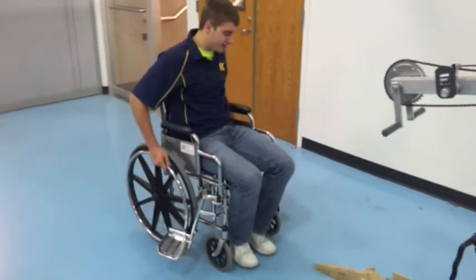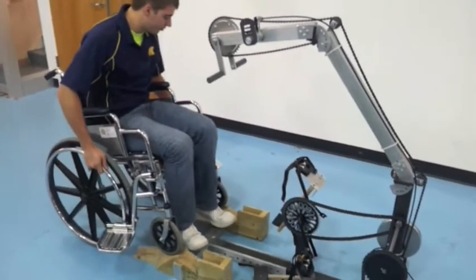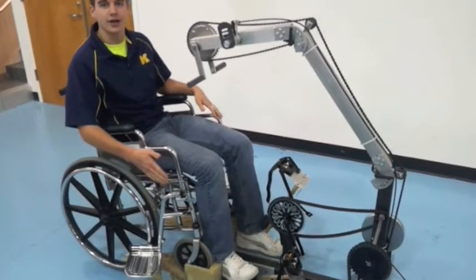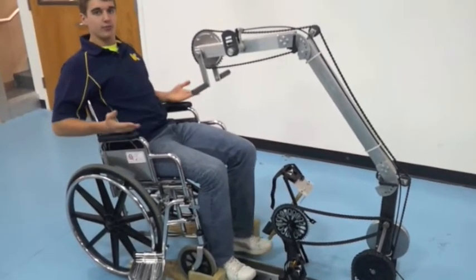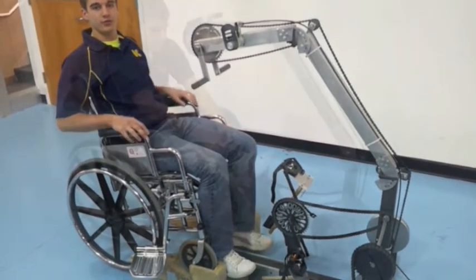As you can see, I am riding up into the exercise bicycle, remaining in the wheelchair, and it locks down into these ramps, allowing the user to stay in the wheelchair. It also puts you at a more elevated level, making it more ergonomic and better to use for the user.